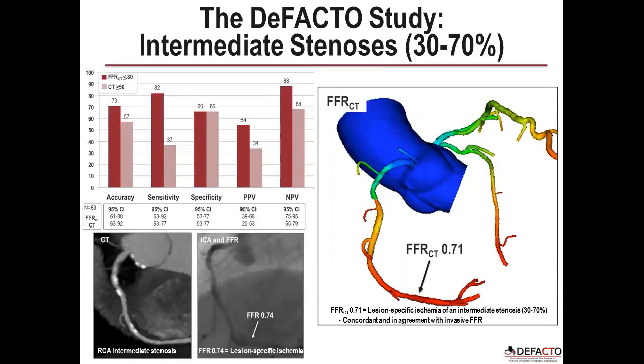Okay, getting to the end. So some of the newer stuff. Have you guys heard about CT-FFR? Okay, you know how it works, right? Good, okay, because I can't explain it. There's a lot of complicated computational fluid dynamics that goes into it, but I just want you guys to know: you just do a CT as normal, and then you send the data to HeartFlow in California, and they send you the FFR. So weird. They have a way of computer modeling hyperemia. So you don't have to give adenosine.